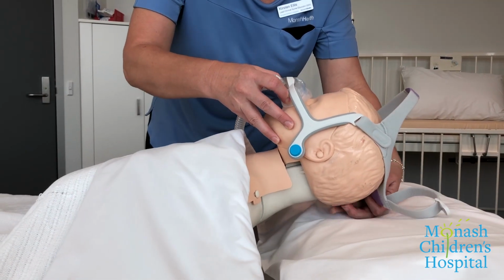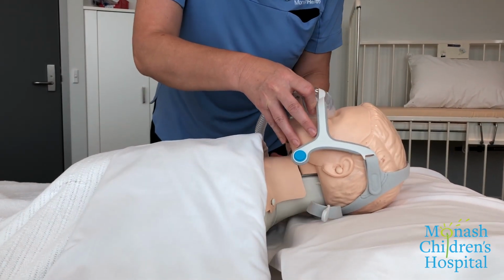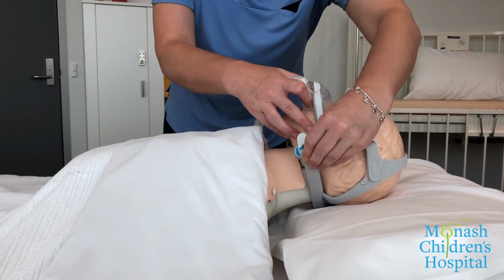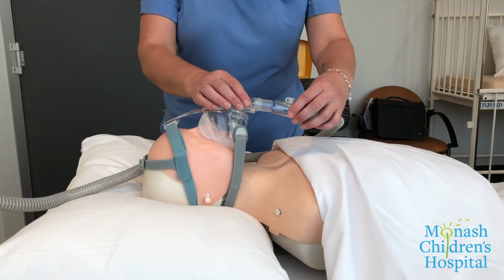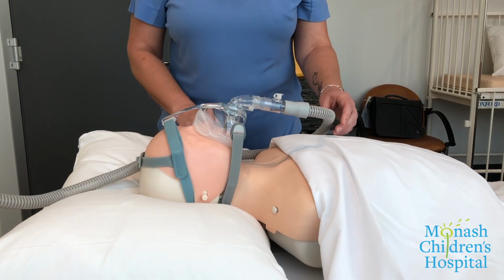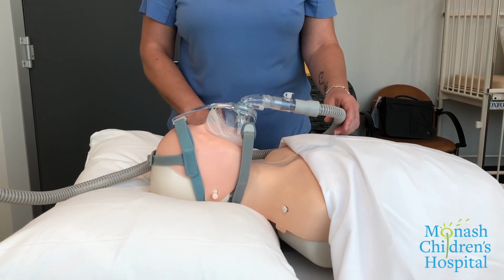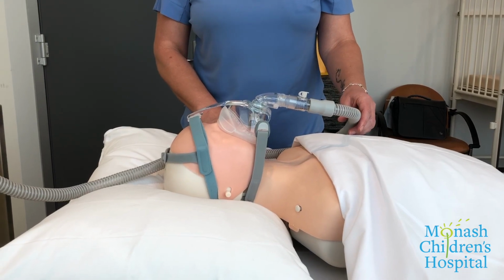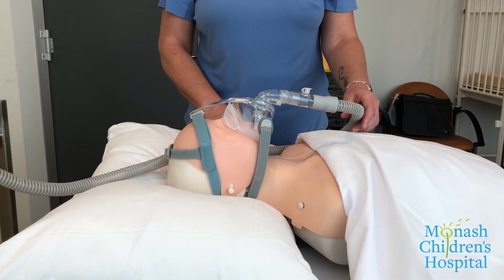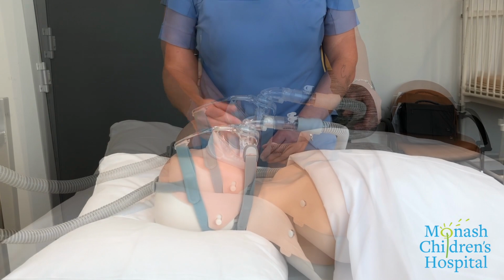There are different mask choices available and you will be guided by the treating team. Here's an example of a nasal mask being fitted to a younger child. Once the mask is fitted, connect the tubing to the mask. The mask should be on without the tubing connected for as little time as possible so that the patient is not breathing into the mask without support. Less than a minute is ideal.